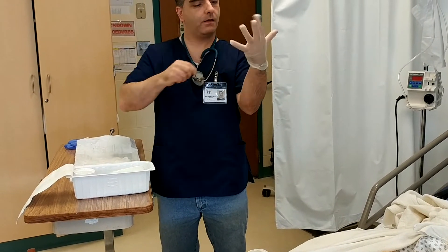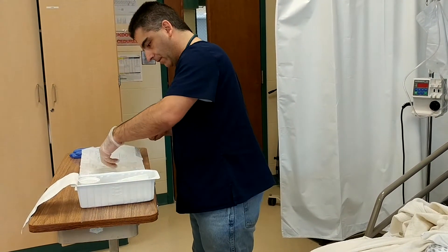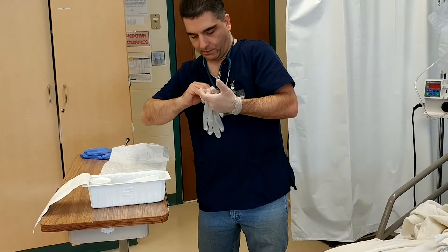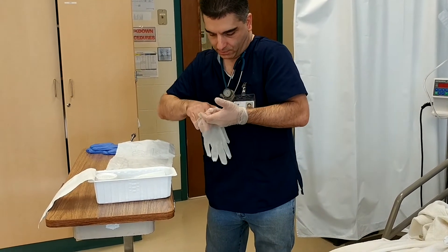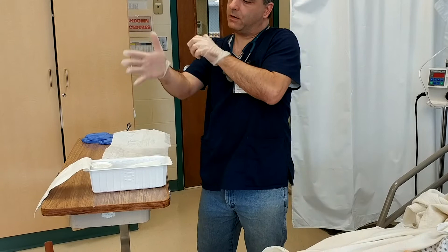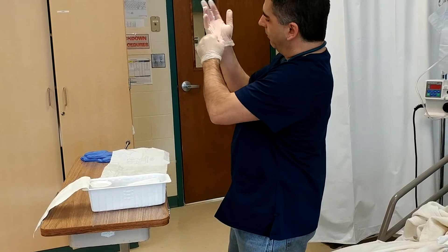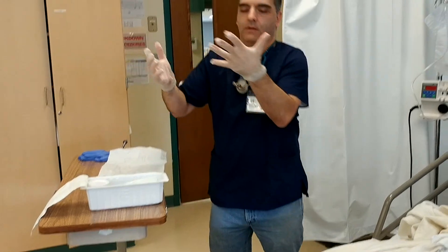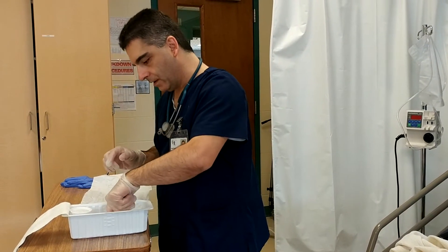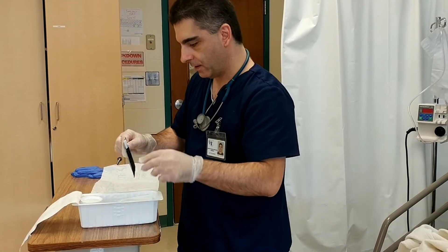I'm going to pull it onto me. Now I'm ready to pull out my left glove — I'm going to grab it, slide my finger in. Since this is sterile, I can touch above as long as I don't touch the skin or around it. So now what do I have to do? I'm going to pull up my stuff and get it ready — my swab sticks. Take off the cap, throw it away, get them ready.